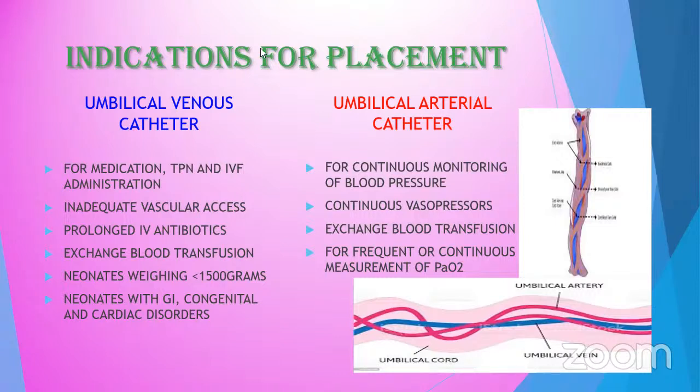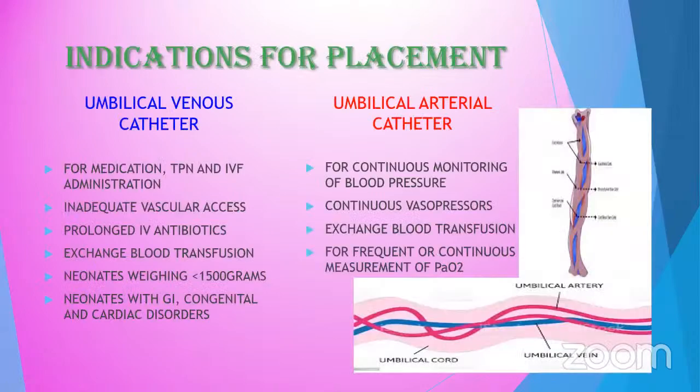As you can see, UVC, UAC. For medication, TPN, and IV fluid, we cannot give via UAC. We cannot give via UAC because it can cause necrosis, and there's some tendency also that we can lose the limbs of our neonates, if I am not mistaken.